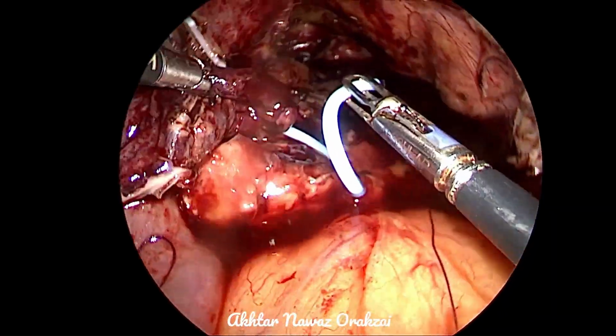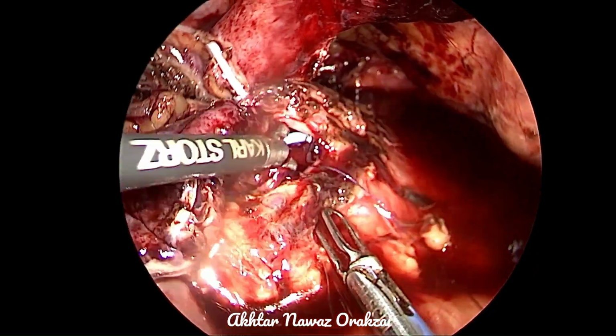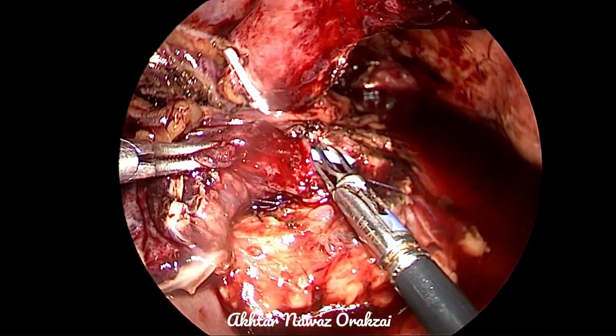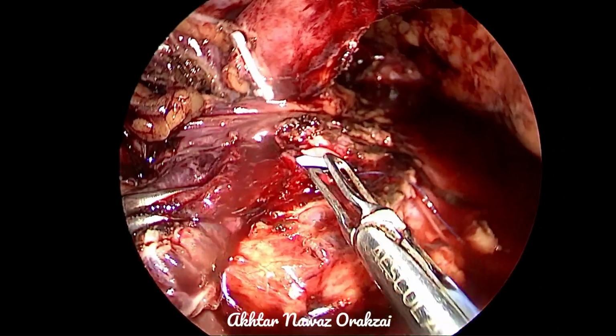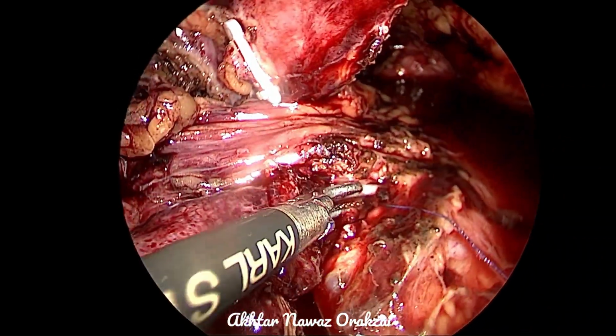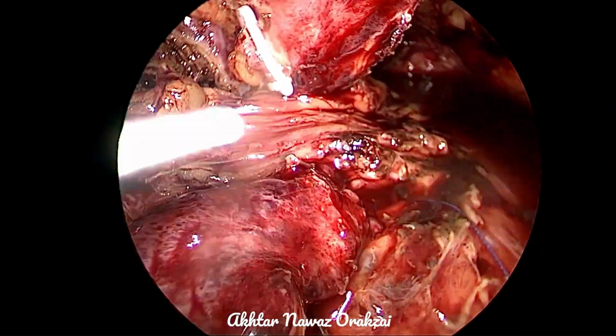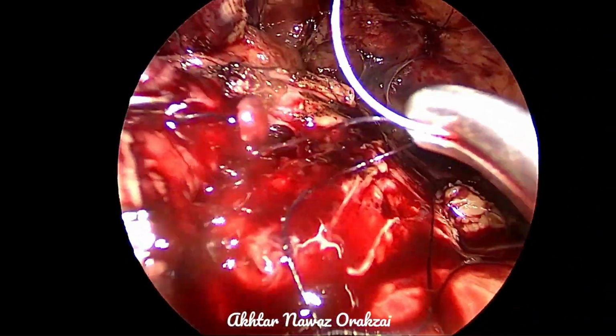So luckily it has reached the pelvicalyceal system, and now the distal end of this stent is placed into the bladder under vision. Care must be taken not to take the stent in the suture, because subsequent removal will not be possible. It will be a disaster.